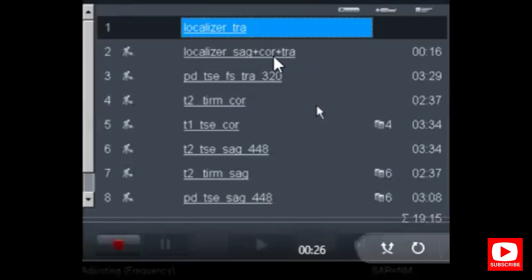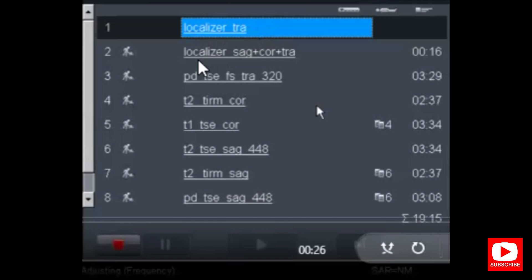Let's introduce the protocols first. There are two localizers. The first localizer gives us only axial images. Then on the second localizer, we plan on the first localizer to get sagittal, coronal, and axial images. From the second localizer, we will plan all the protocols.